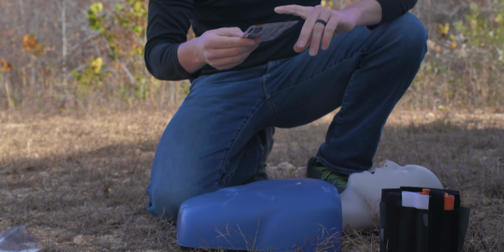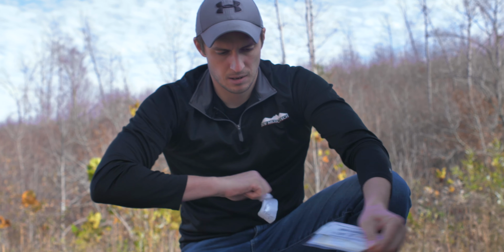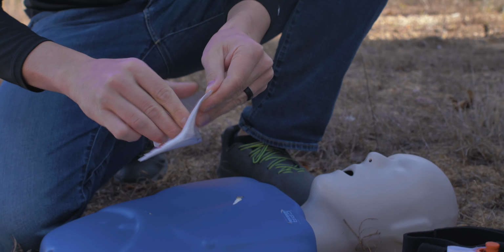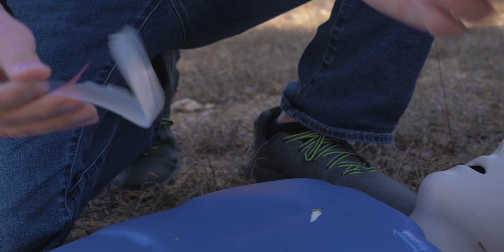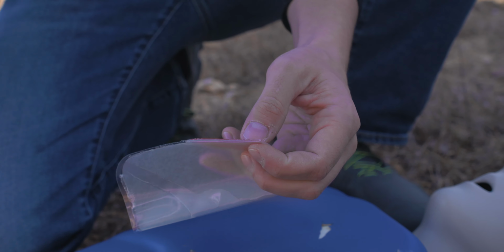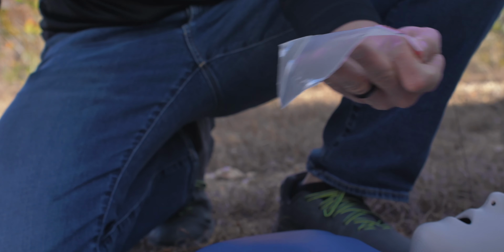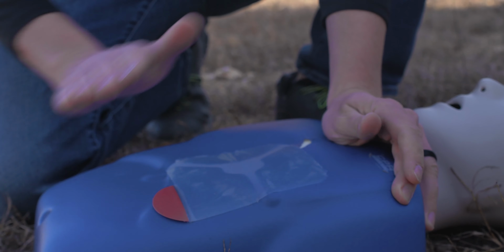All right, next up is one that has been sitting inside in training supplies, 2 years old. I'm not expecting to have any issues out of this one either. Open it up, pull the 4x4 out. Looks good to go. Again, I'm not sure why this tab is perforated, but it creates a little bit of an issue when you go just to yank it off. Comes right off, peels nicely, slap it on, sticks well.